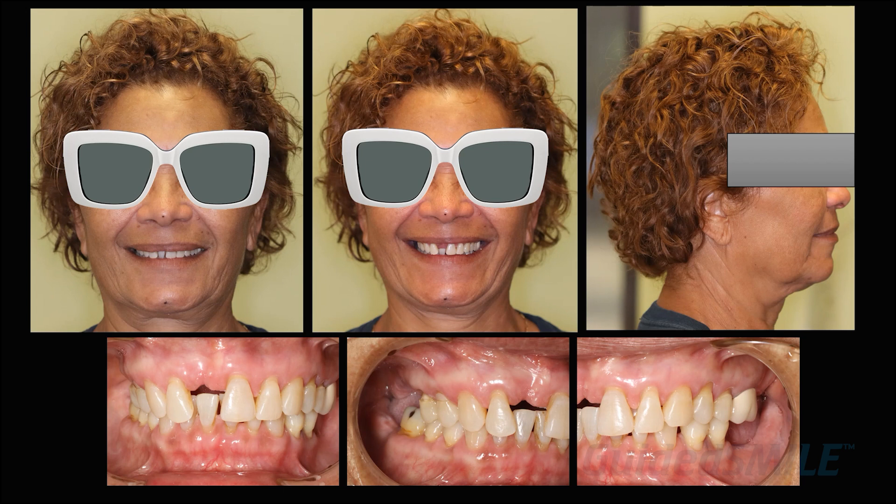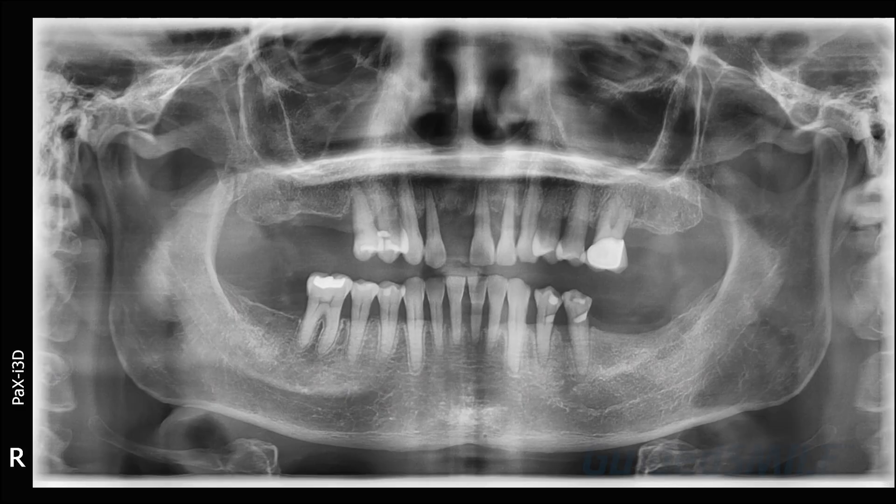It's nice to have really clear images. In this particular case we're going to open the bite — I'll show that in a minute. The photograph records are excellent. The doctor sent in a panoramic X-ray, but also sent in a CBCT.